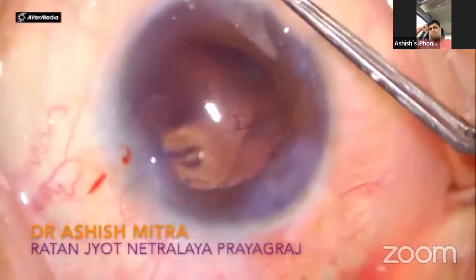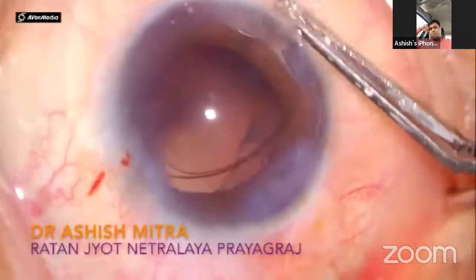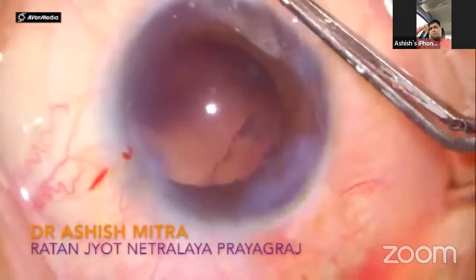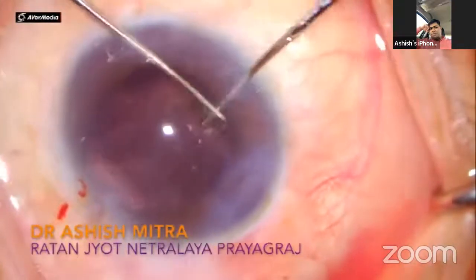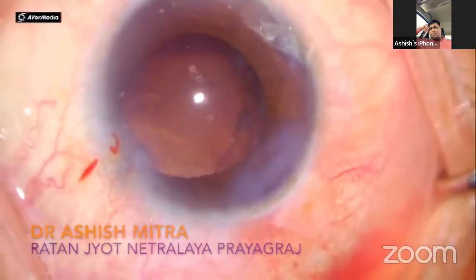After injecting Visco, the bag was inflated and I made another side port to help me insert the CTR into the bag. You can see the leading haptic is being passed into the bag, and you have to be gentle. Your rhexis should be intact for inserting a CTR. I engaged it with one dialer, and the other dialer I'm using to deposit it in the bag, and the CTR went nicely in the bag.